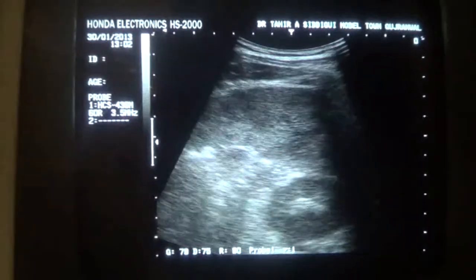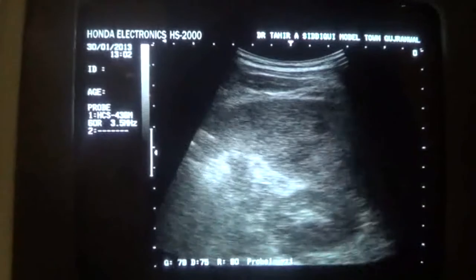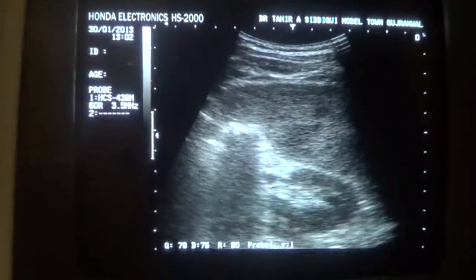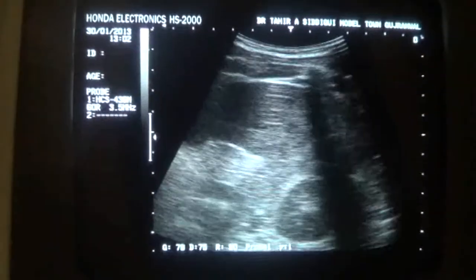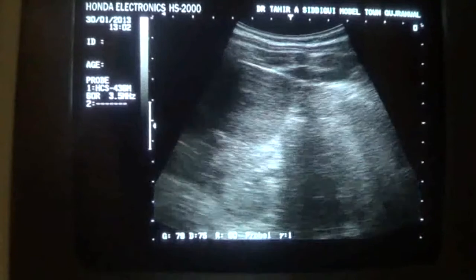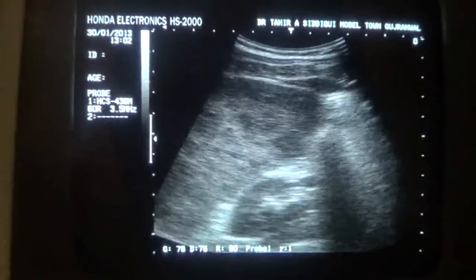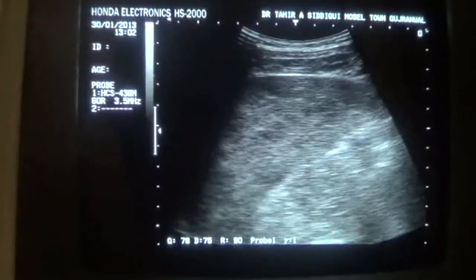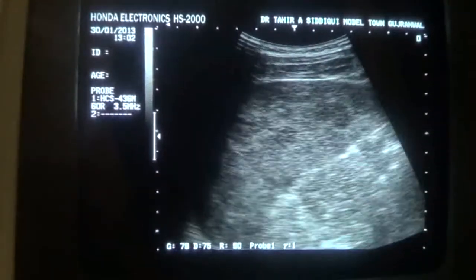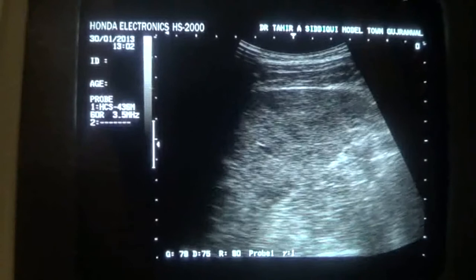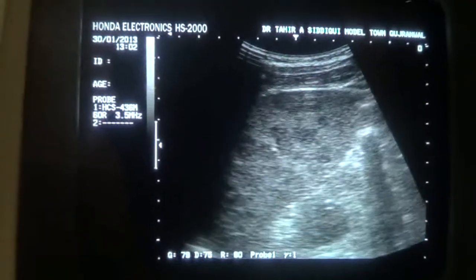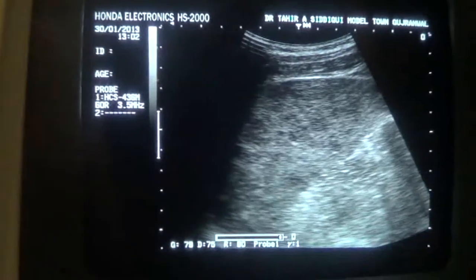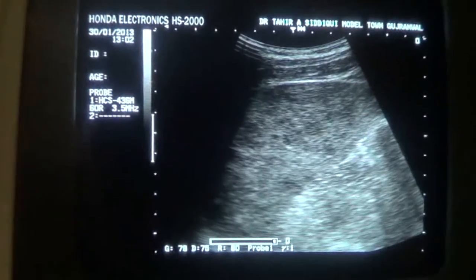This is the kidney in transverse section, with the spleen anterior, and you can see the focal lesions. So this is the case study of focal lesions in the spleen involving all of the splenic parenchyma.